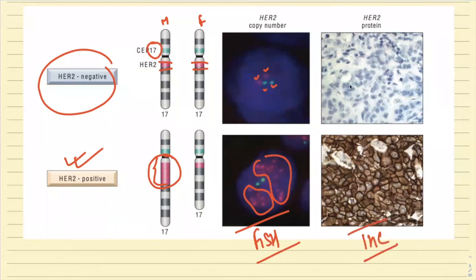Now over here, it is HER2 negative. There is no stain. But over here, this is HER2 positive. Now for HER2 positive, there is a criterion from the WHO. There should be complete membranous staining. You can see that around the cells, like this. Over here, there is a brownish coloration of the membrane, and this complete and intense staining of the membrane is taken as positive for HER2.